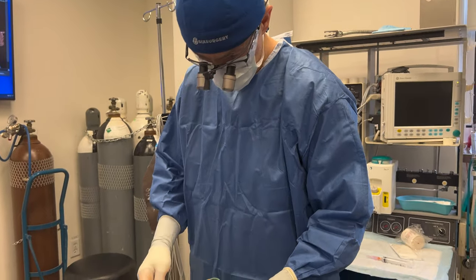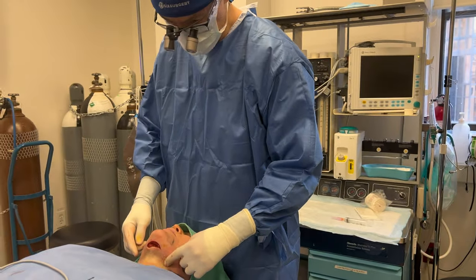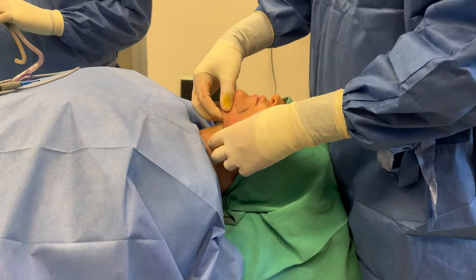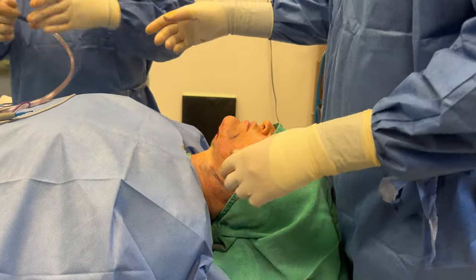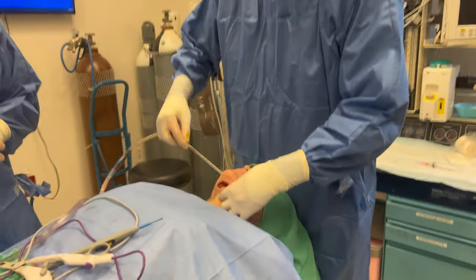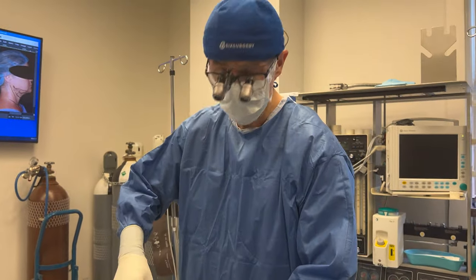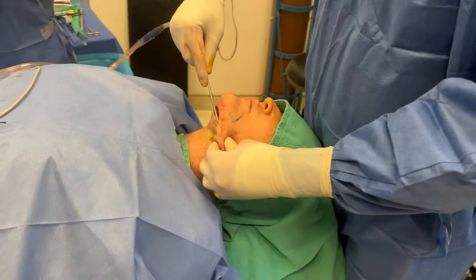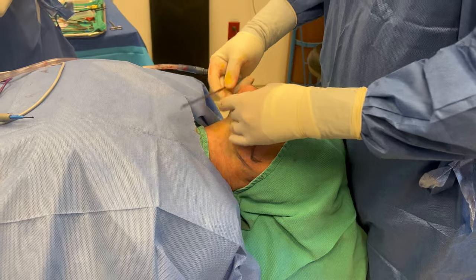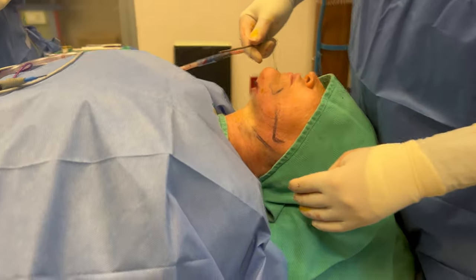We've finished trimming the submandibular glands. You can see a little empty space here on both sides. Now there's just a little tiny liposuction — just a little touch-up to smooth things out. I also tightened up the platysma muscle to give it a nicer contour, and now we are done.